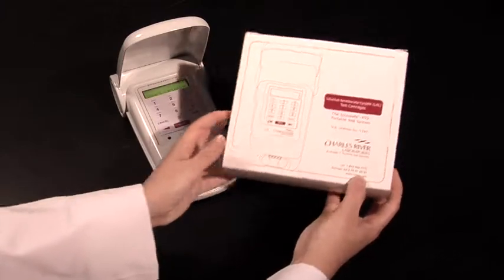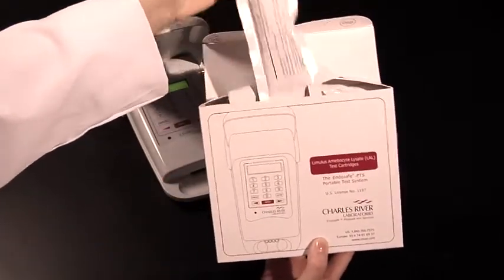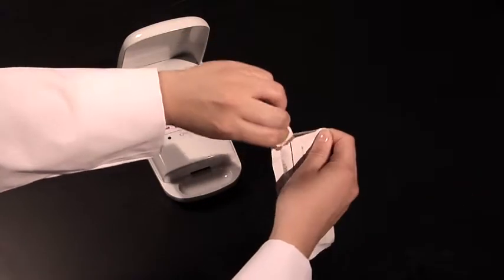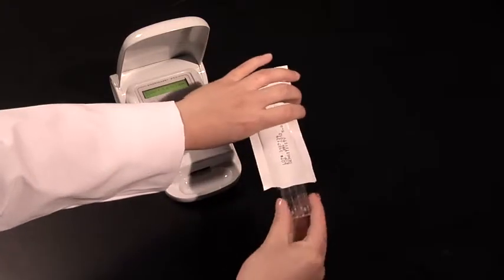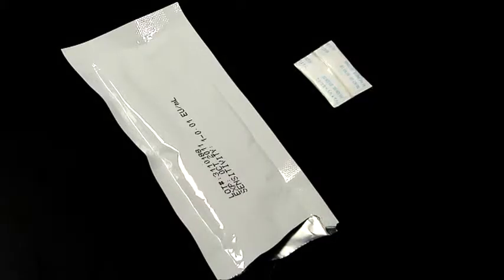Before doing so, if you have refrigerated the cartridge, please remove it from the refrigerator and allow it to warm to room temperature unopened while still in its pouch. Once at room temperature, please remove your cartridge from its pouch by only touching the edges of the cartridge. You will notice there is a desiccant in the pouch which can be discarded.